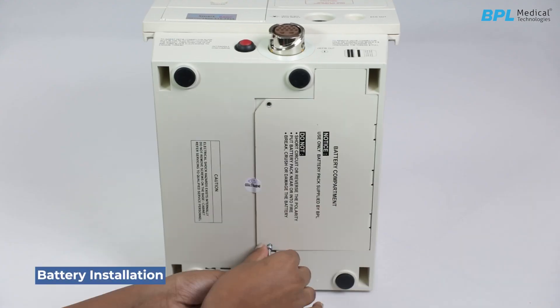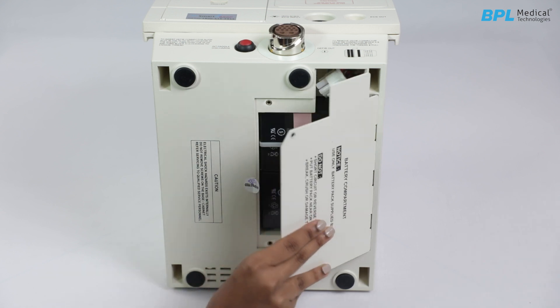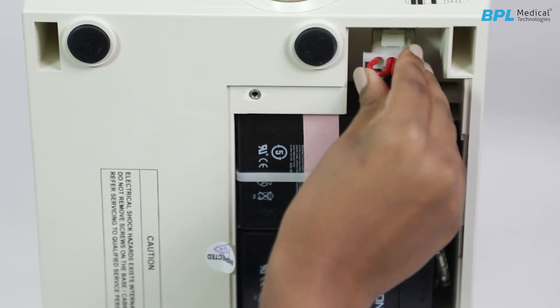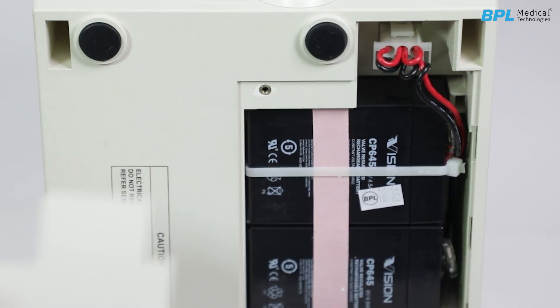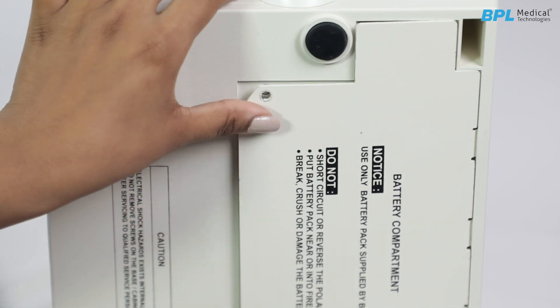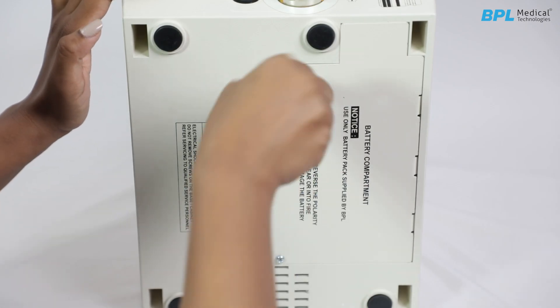Battery installation. Remove the two screws retaining the battery compartment and lift the battery lid. Align the polarized plug with the connector inside the compartment and push the plug fully into the connector until it gets locked. Route the battery cable properly so that it is free and will not get jammed between the battery lid and the case. Replace the battery lid and secure the two screws tightly.